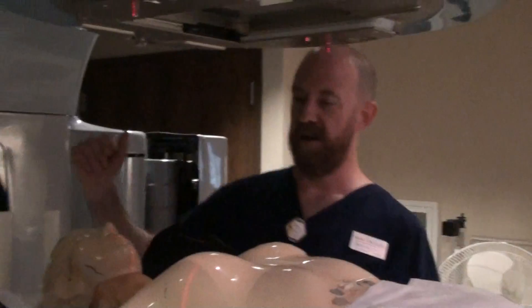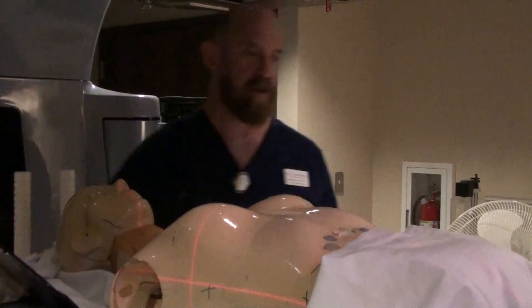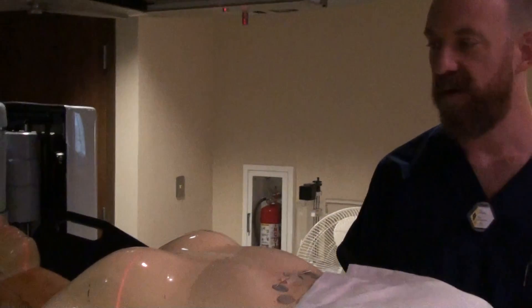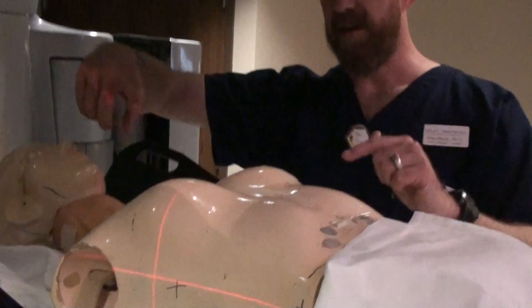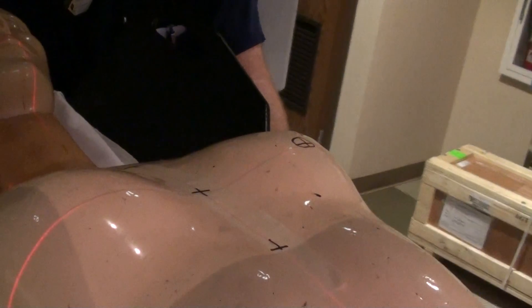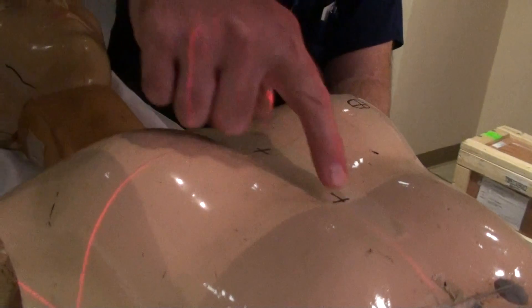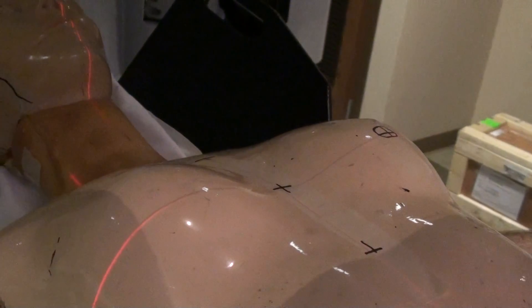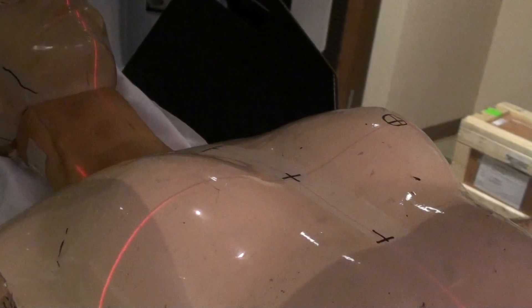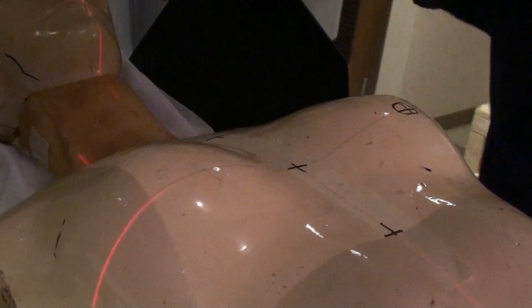If you're off, you need to align your patient such that all of your marks are on the same side of the fence, and then your driver drives back onto your CR mark, and then you check and see if you're still on. It needs a little bit more — it's not quite perfect. We're going to move her just a little bit more to where everybody is equally far off of the CR and on the same side of the CR. Then we're going to adjust in-out and left-right. That's pretty good. So we're in line three points, so you know you have her straight.